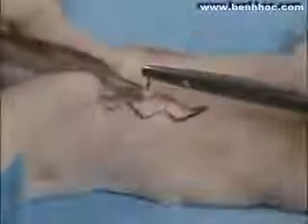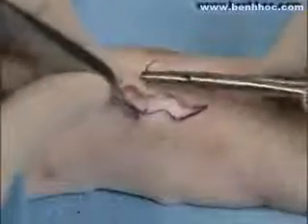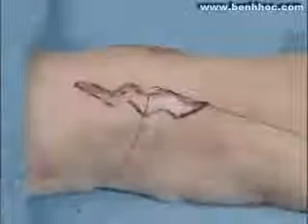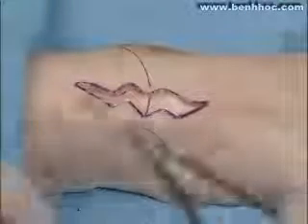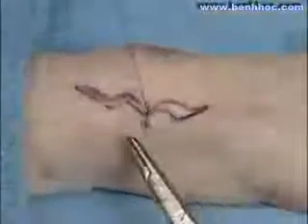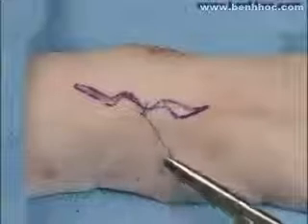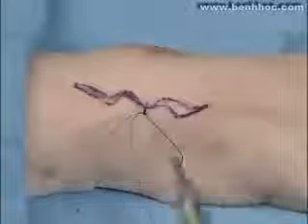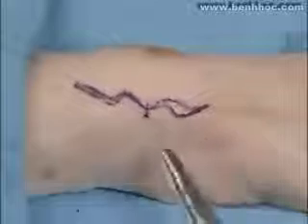Now, finger pressure is used to make sure that it can be closed easily. Deep sutures may be placed when necessary, and it's usually best to use deep sutures with a long-lasting life so that they are in position for a long time. Then eventually they may dissolve. This will allow the deeper tissues to be closed and keep the tension off the skin sutures.